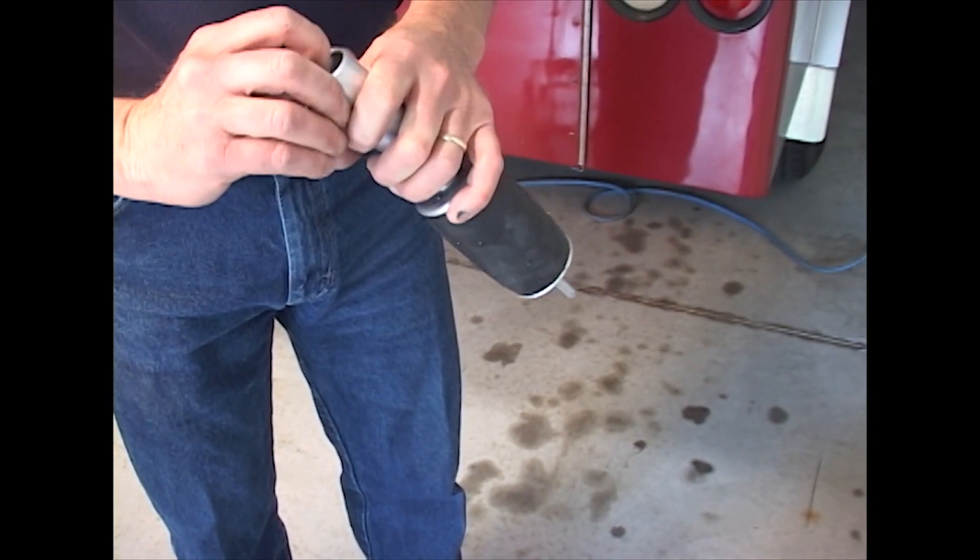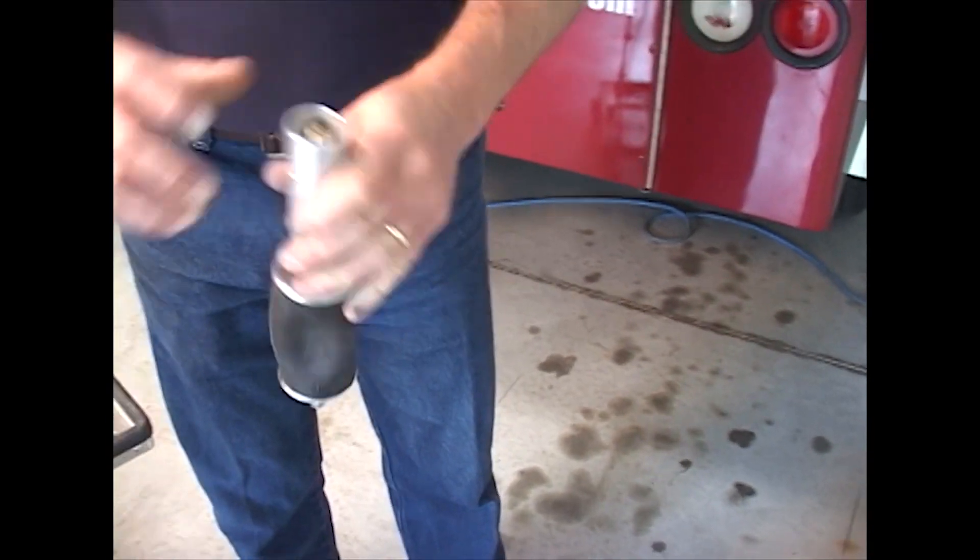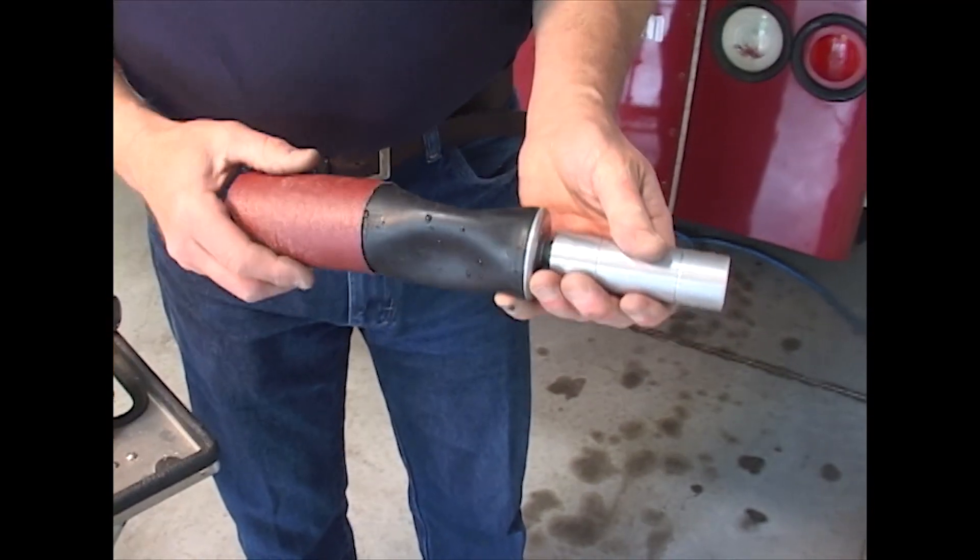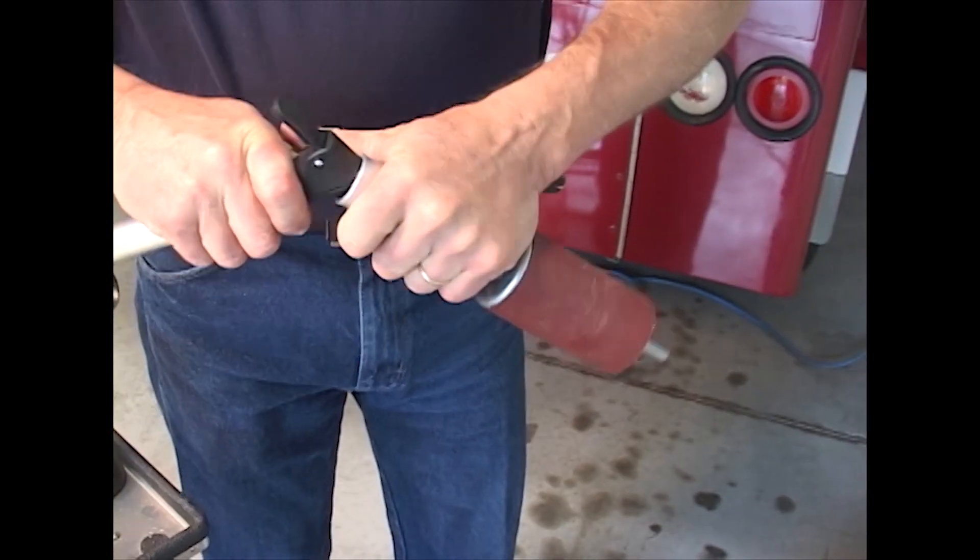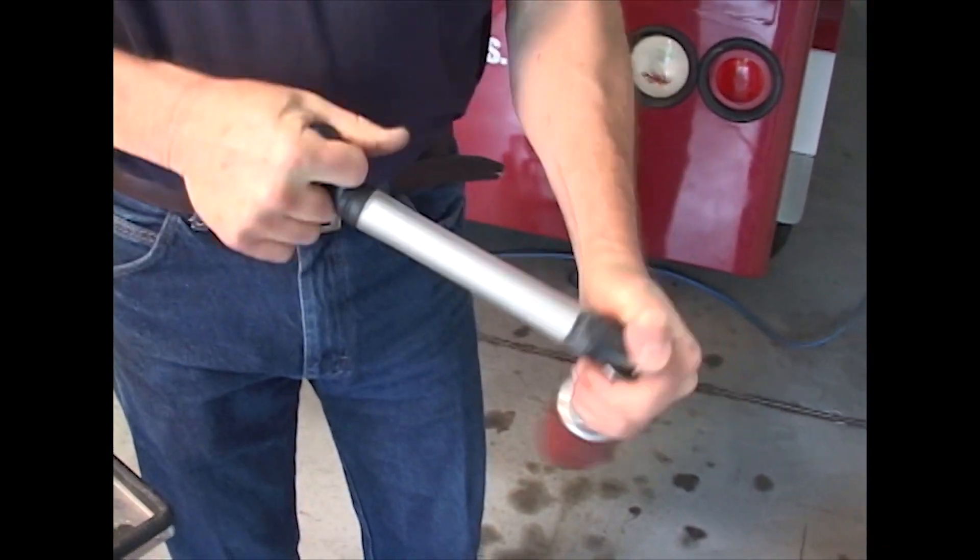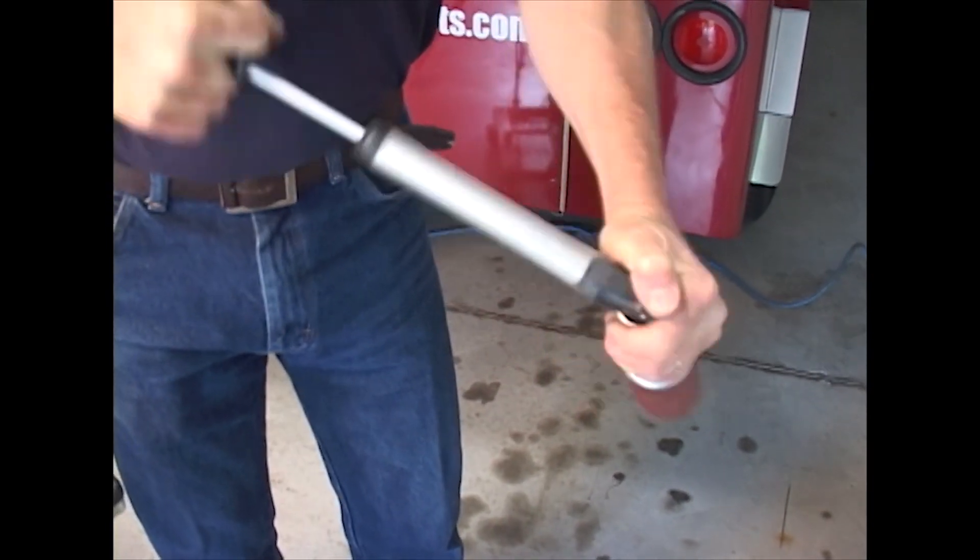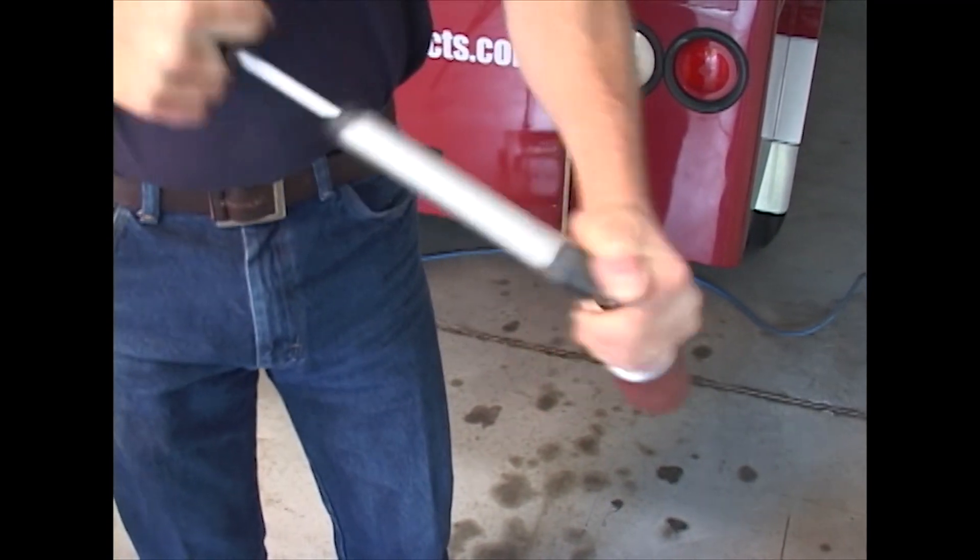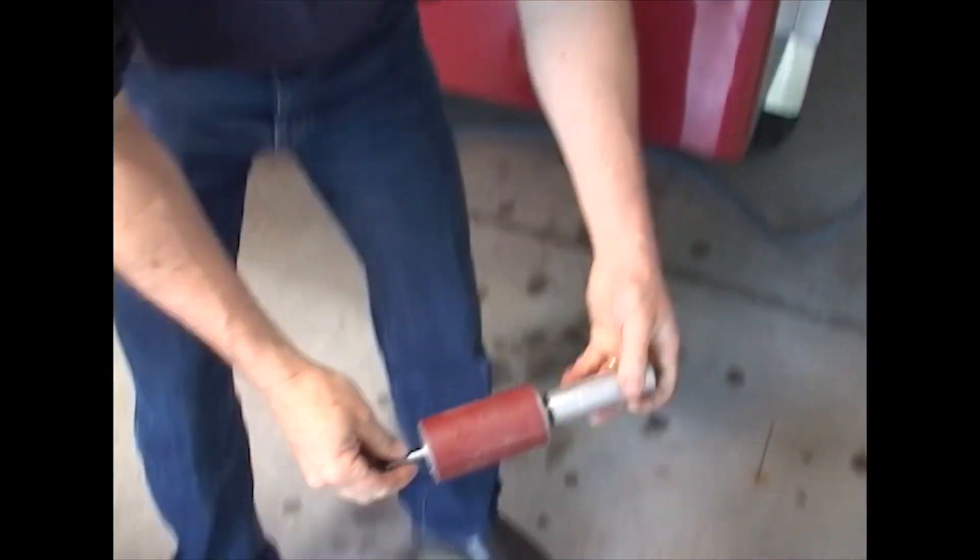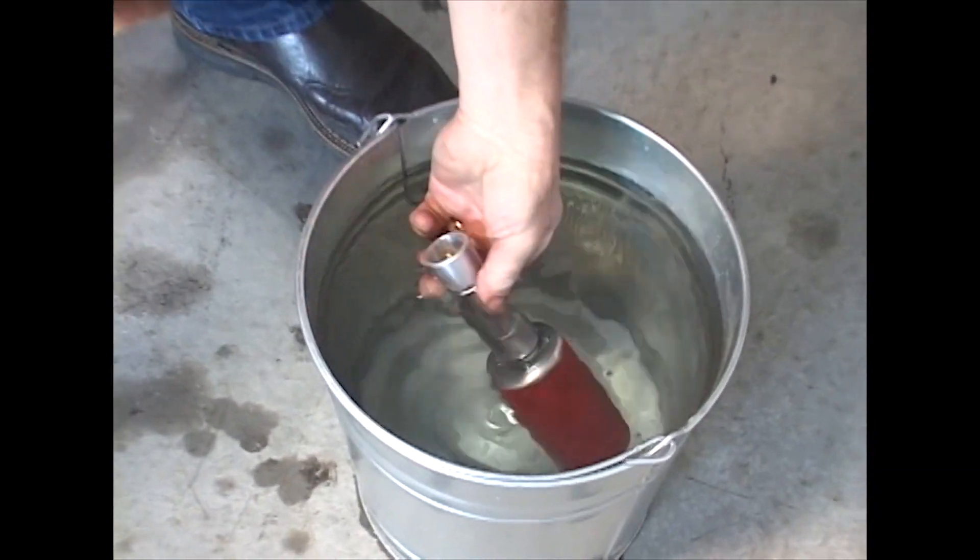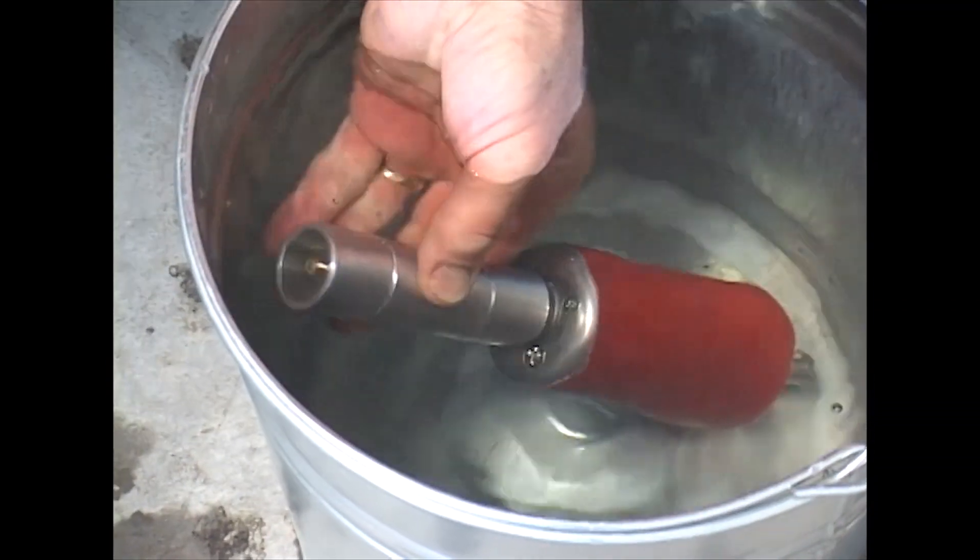If the bladder is sound and you don't see any leaks, deflate the unit again, put the sleeve over it, and now you want to pressurize it again. Then you put it in the bucket and observe if there are any leaks.